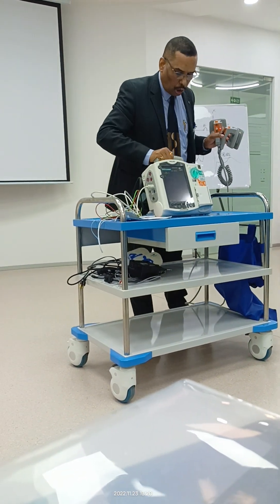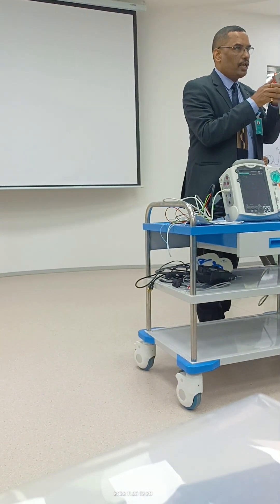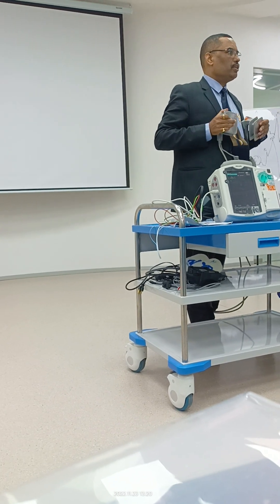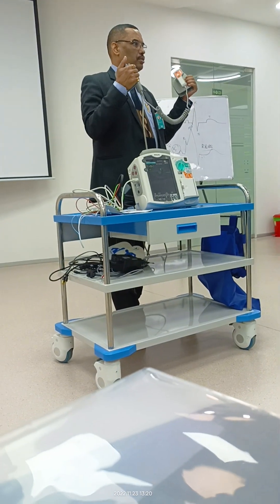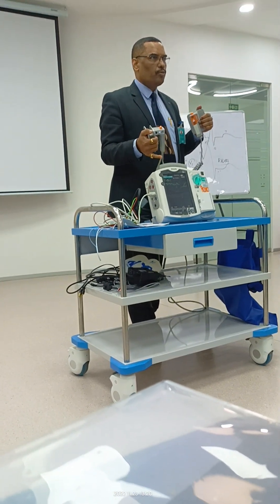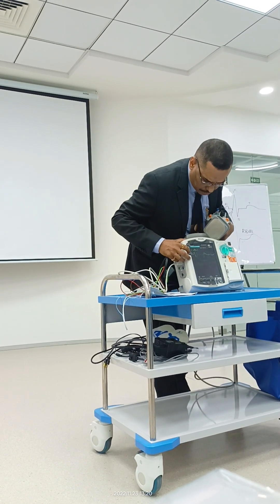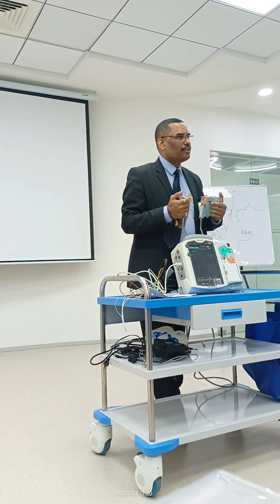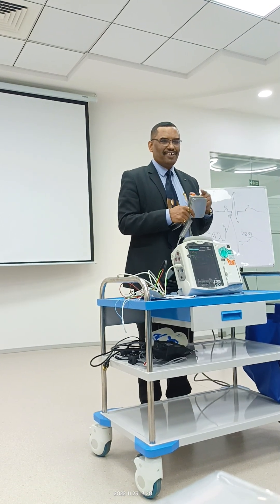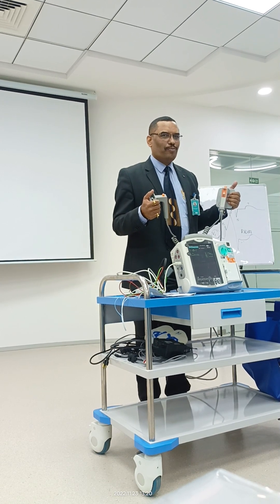The machine is on and the paddles are connected. I place them on the chest location — am I connecting to myself? Are you getting rhythm on the monitor? It's not coming. Why is the rhythm not showing? The alarm beep sound is not coming either — it's silent.